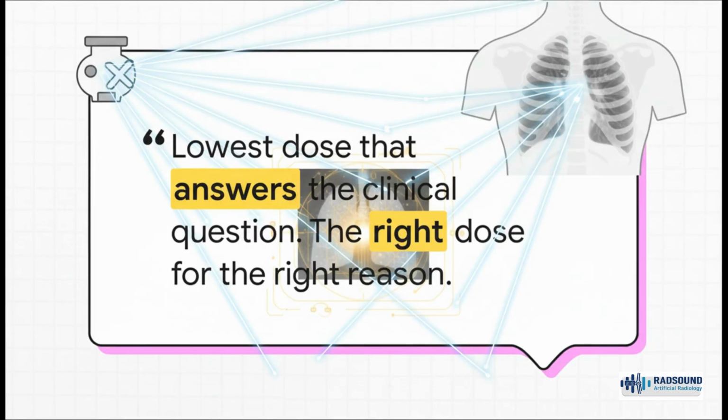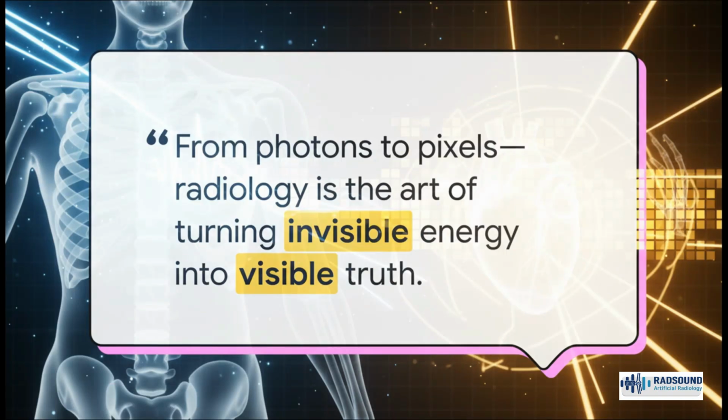And this quote right here, it just perfectly sums up the modern way of thinking. It's not about just getting the lowest possible dose, because that might give you a useless, noisy image. It's about finding the right dose for the right reason, the dose that gives you the answer you need and nothing more. And in the end, that's what this entire journey is all about. It's this incredible process of taking something completely invisible, a beam of energy, and through the precise application of physics, turning it into a visible truth that can literally save someone's life.